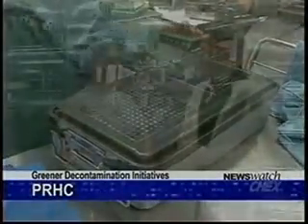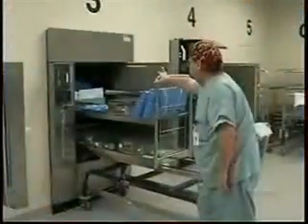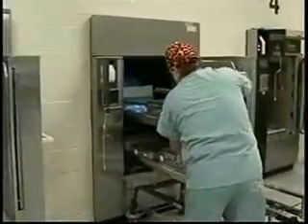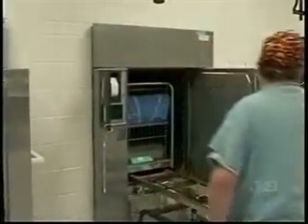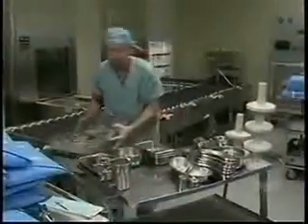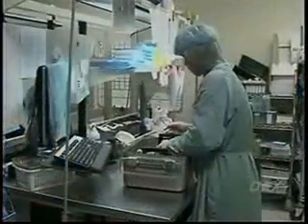Okay, that's great. So what are these containers used for? The containers are used to house the medical equipment that's been reprocessed through the decontamination step, also through the setup and prep area, through sterilization, then they've landed on this cart to make their way to the end user, which could be the operating room, emergency department, ICU, diagnostic imaging, anywhere that needs sterile equipment.